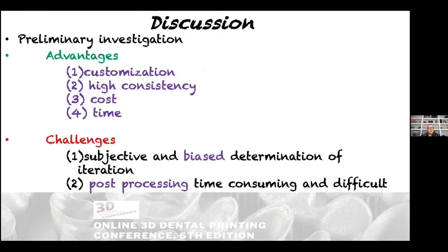In terms of discussion, this is quite fun. So this is a preliminary investigation. We haven't gone into a clinical space at all, but there's definitely some inherent advantages of doing an additive manufactured workflow for a dental implant component. And the first one is customization. I try to really highlight that. If you need to tweak something, the diameter, the length, it's so easy to do digitally, and then the output is pretty simple to do. If we're doing it old school, traditionally, that effort is much, much higher.